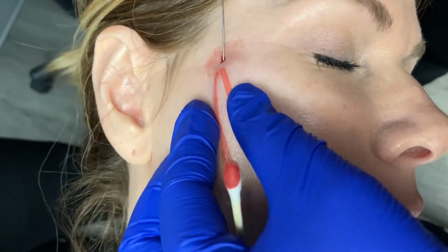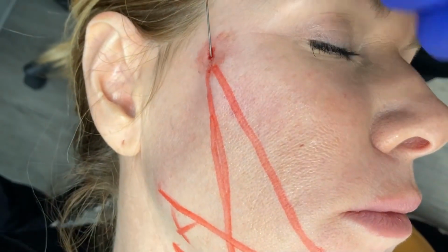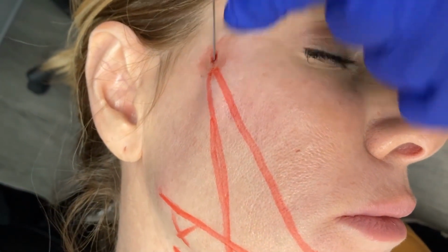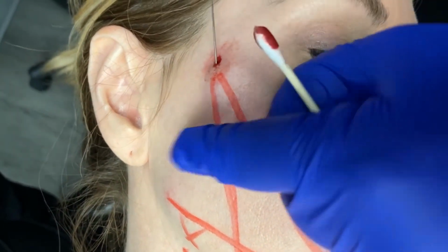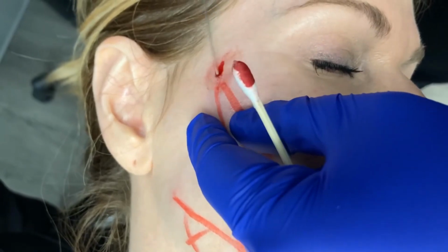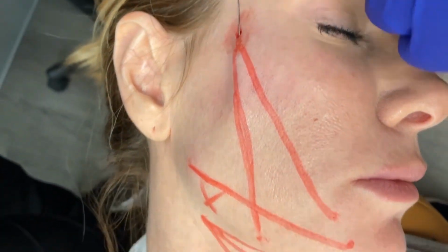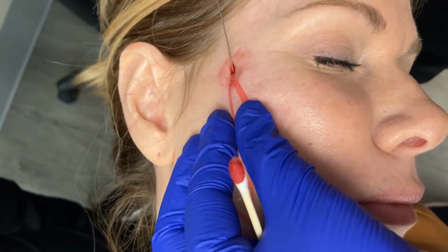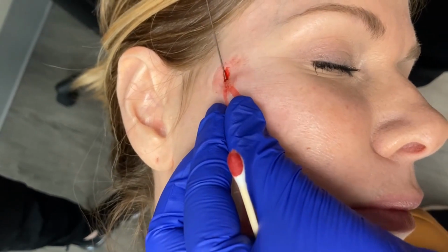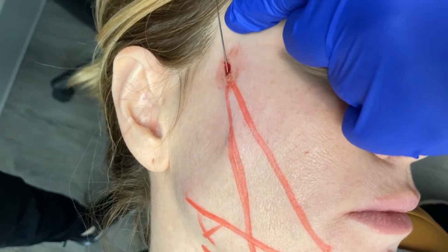We are going very gently, and we are going to lift the skin many times over that microcannula, as you will go ahead and see, using our non-dominant hand to make sure we know where it is, make sure we're in the right plane, and that's going to be the subdermal plane right on the SMAS as we go down into that tunnel, and using the other hand and kind of push the curtain over the curtain rod very gently. Never force anything, and make sure that this is very, very controlled.